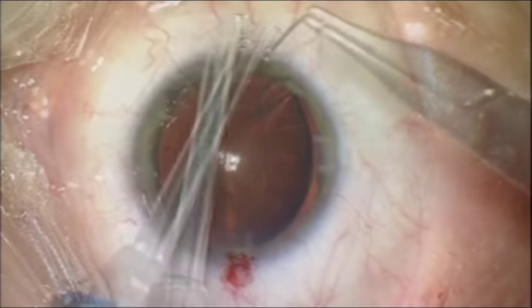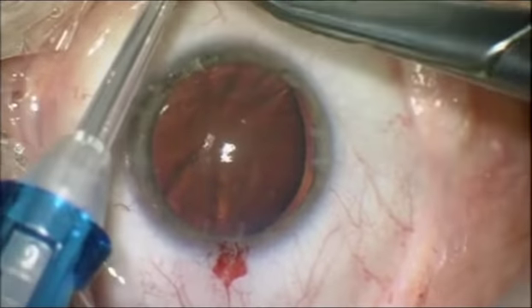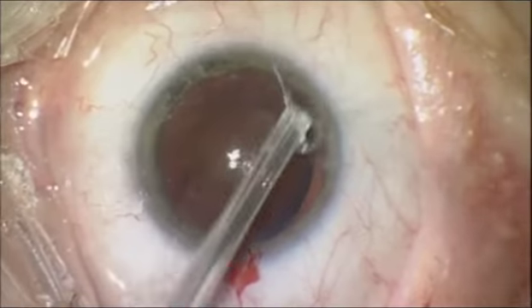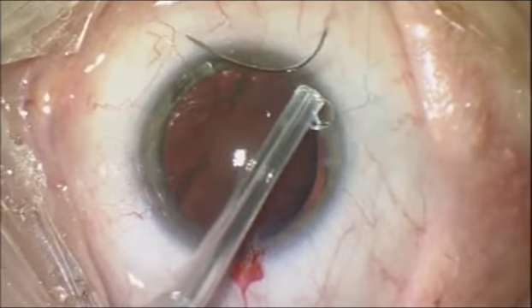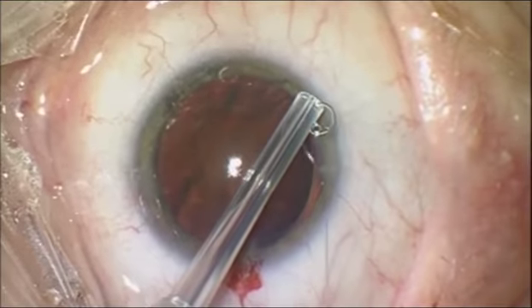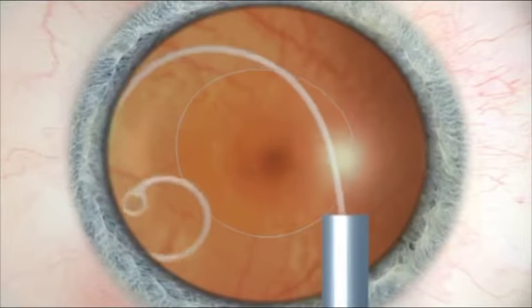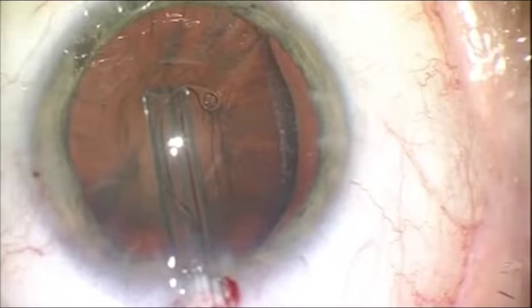Here is the case of the patient with traumatic zonular dialysis. CTR is completely retracted inside the injection device. Eyelet of CTR is fixated to the 9-0 polypropylene suture that will be used later for scleral fixation. During injection, the device is easily sliding along the equator of the capsular bag.